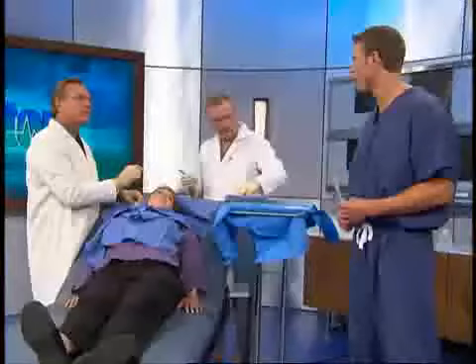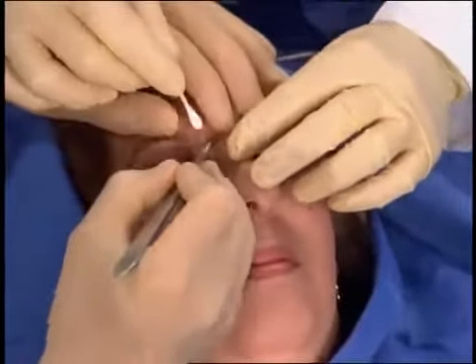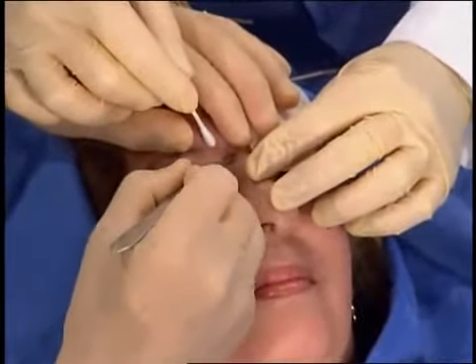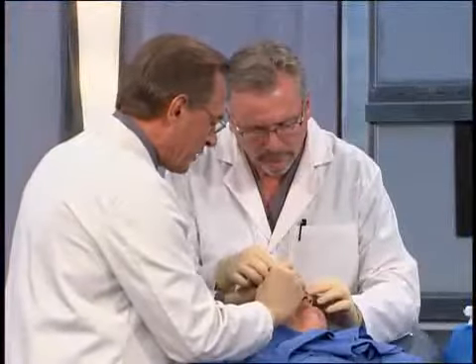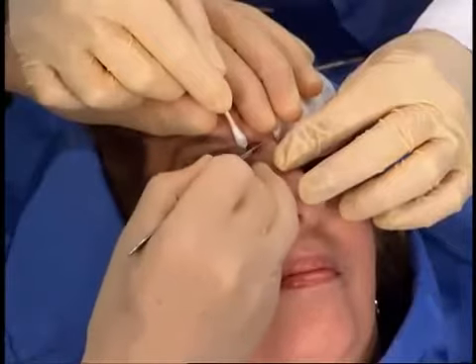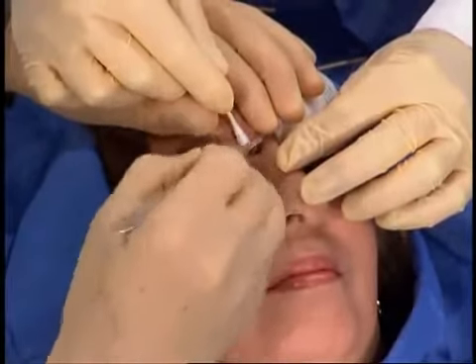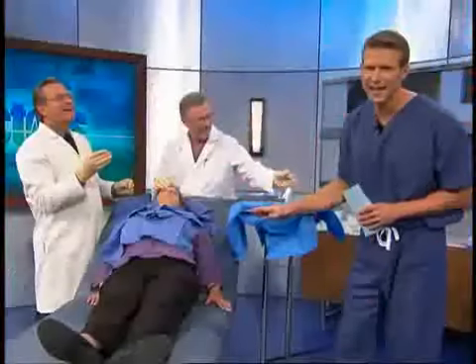So Travis, walk us through this. We're going to do a little plastic surgery. She's completely sterile here, and I have a great assistant here, Rob, working with me today. I'm doing a special cut with the scalpel, beveling it so that I have edges that will be everted when I close this mole. You're not feeling a thing, right? No. I hope it's numb. Yeah. She was anesthetized before she came out. You know, this is her face.